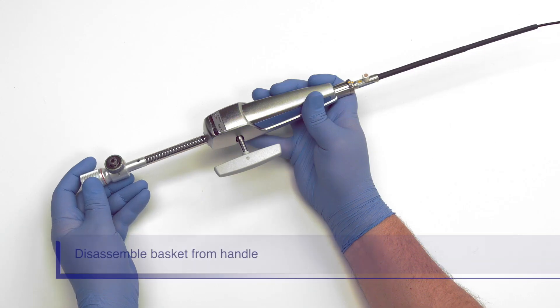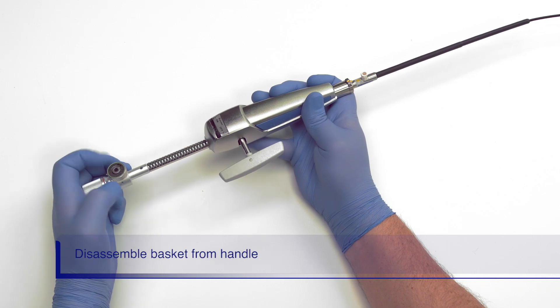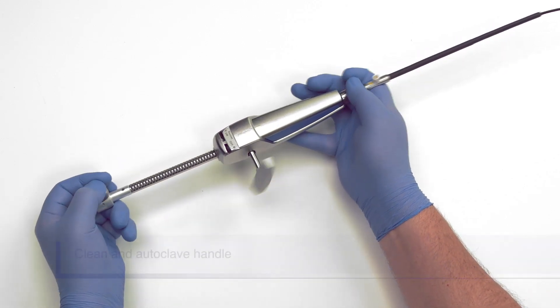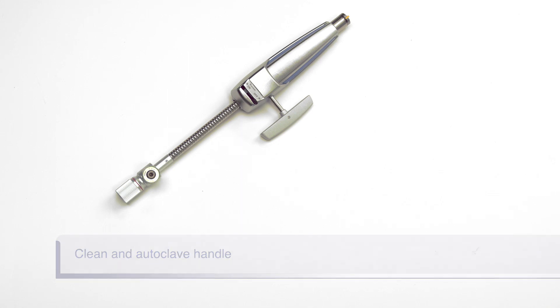Now that we are done crushing the stone, we need to disassemble the handle and basket. First, loosen the release button by turning it counter-clockwise. Then push the release button and yellow button simultaneously while pulling the handle away from the basket. After the procedure, dispose of the basket. The handle is reusable and needs to be cleaned and autoclaved.